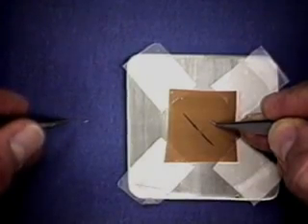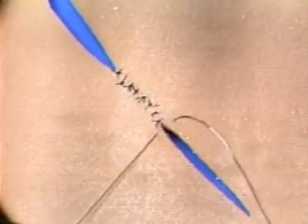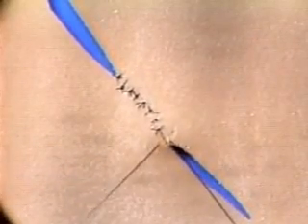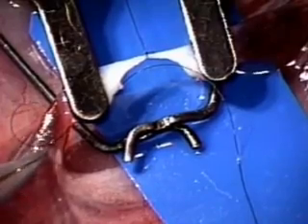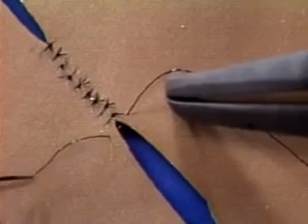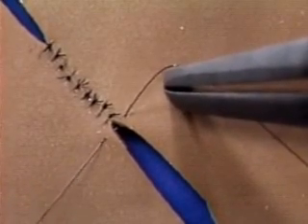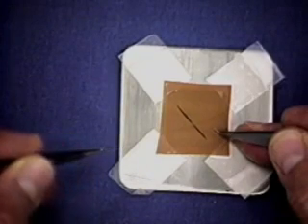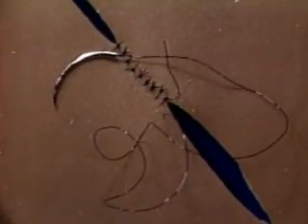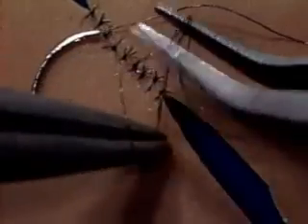To pull the thread through, pass the needle to your left hand forceps and make a long steady movement while carefully watching for the end of the thread. When the end comes into view, stop pulling and drop the needle — where it lands doesn't matter. Two things to avoid when pulling the thread through: first, avoid having the thread coming through the tissue at an angle rather than in a straight line — with just a little drag the angulation can cause the thread to cut through the tissue, which a blood vessel won't withstand. Use your right hand forceps as a pulley whenever needed so the thread passes cleanly in a straight line. Second, avoid bringing the needle and a lot of thread back into the field of view before you tie the knot — that complicates the picture enormously.